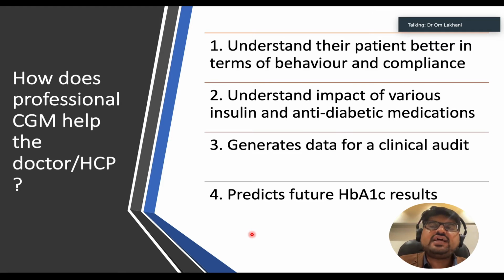It helps you understand your patient better in terms of behavior, in terms of compliance. It helps you understand the impact of various insulin and anti-diabetic medications. When I started my own practice, I used a CGM a lot. So it really helped me learn more about how does an acarbose work? How does a GLP analog work? How does a particular SU work? How does the other SU work? How does a basal insulin work? How does a premix insulin work? So all these things, you learn better.